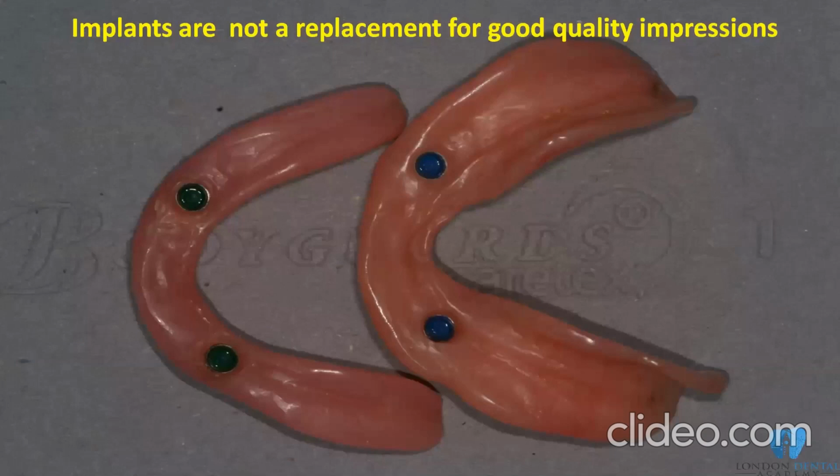And these, as you can see, are the dentures, the old and the new one. Probably, had I done this denture without the implants, as you can see, very nice retention. You will get better retention, better stability, better functionality of the denture. As you can see, almost double the size. Border extension is quite good. But having implants in place is always, I think, a bonus for the patient, an enhancement for your treatment outcome.